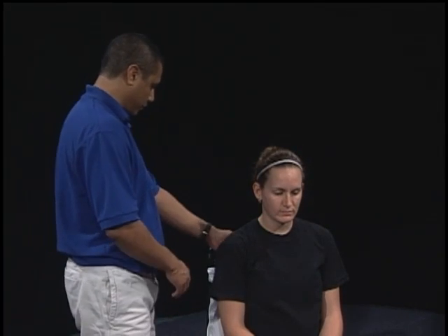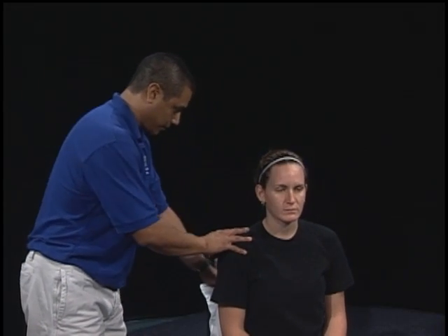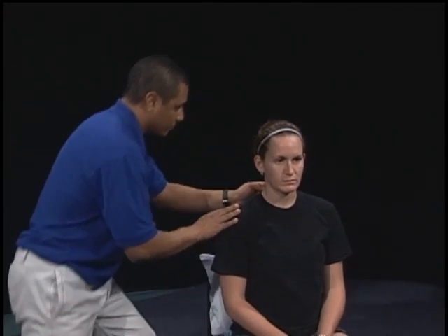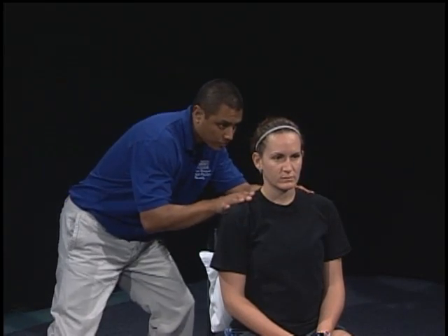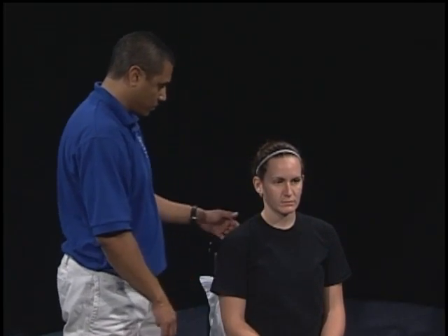Position the patient in sitting with the thoracic and lumbar spine well supported by the back of a chair. Position the cervical spine in 0 degrees of rotation and lateral flexion. If necessary, the patient can hold a tongue depressor between the teeth for reference. In patient-appropriate language, ask the patient to flex the neck.